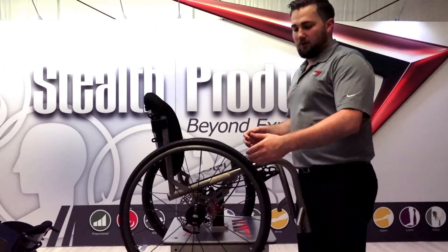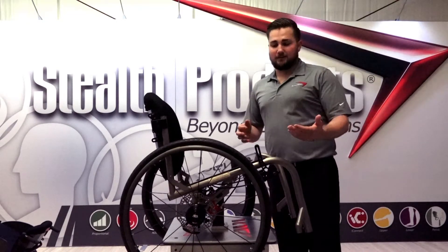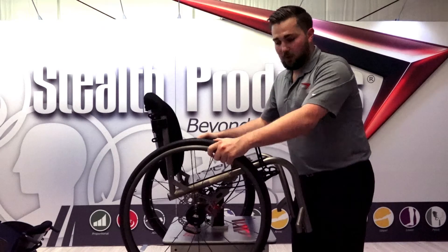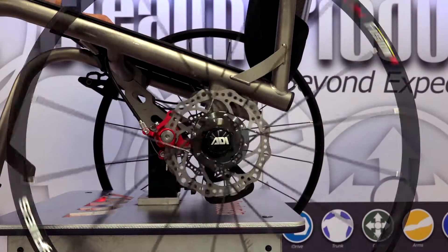In the manual mobility industry, we have a terrible habit of calling over-center wheel locks 'brakes,' when in actuality they are just that — locks. What this system is is a full-on brake system.